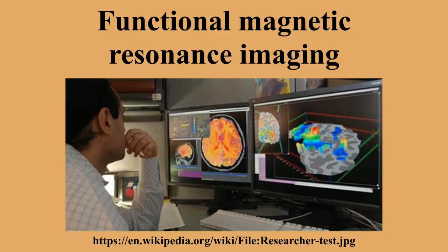The vascular arterial system supplying fresh blood branches into smaller and smaller vessels as it enters the brain's surface and within brain regions, culminating in a connected capillary bed within the brain. The drainage system, similarly, merges into larger and larger veins as it carries away oxygen-depleted blood. The BOLD contribution to the fMRI signal is from both the capillaries near the area of activity and larger draining veins that may be farther away.